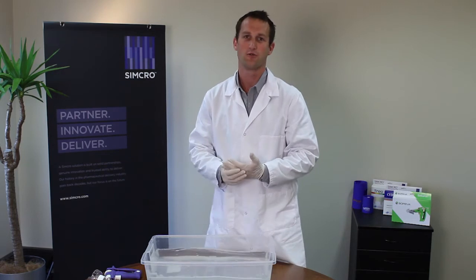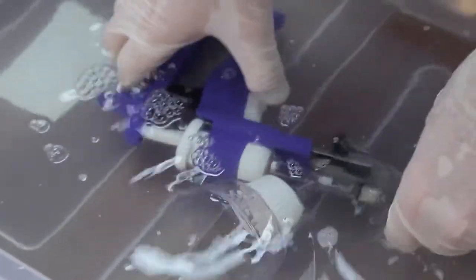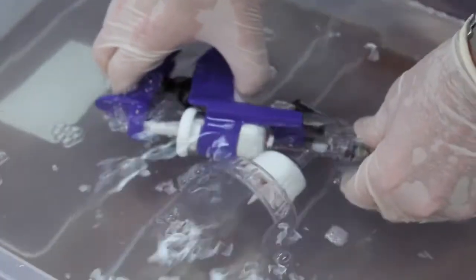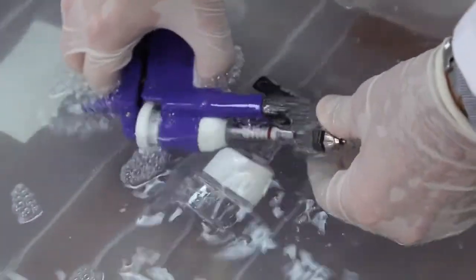A barrel, hand basin, just whatever you have — nice clean soaking water. Simply drop the injector in there, push the needle guard back and follow those steps: one, two, three. And we just pump the product through there.